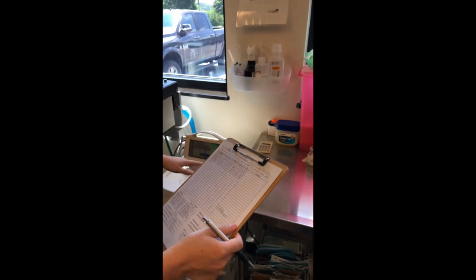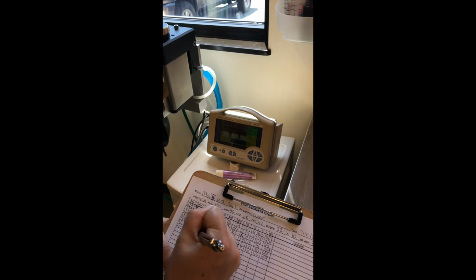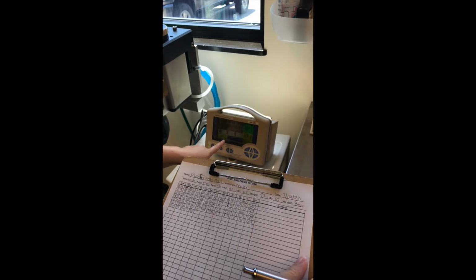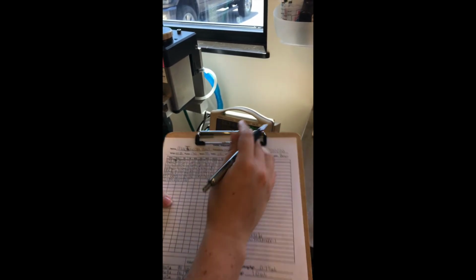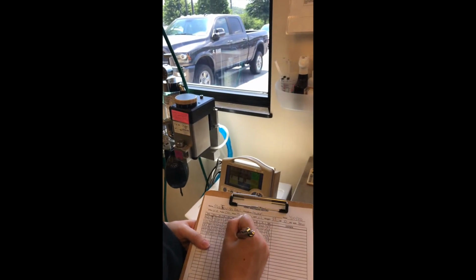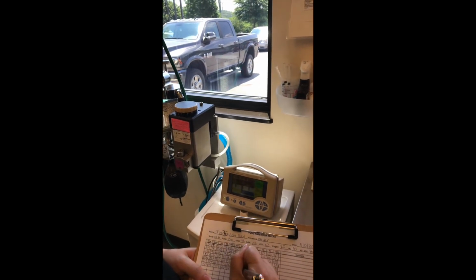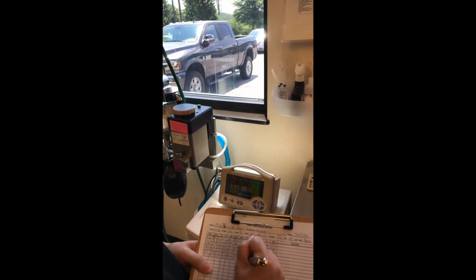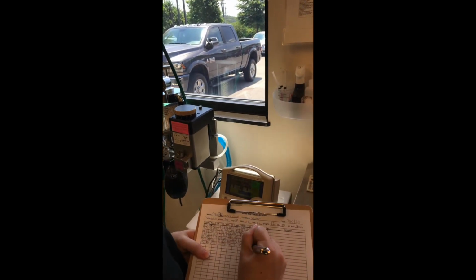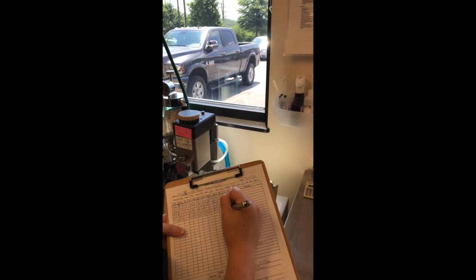And we have everything here that we read off of. His temperature is reading at 99.6. Heart rate is at 107. Respiratory rate is 26. He is nice and pink. His SpO2 is 100. Blood pressure is 130. EtCO2 is 57. His ISO is at 1.5. Oxygen is at 1. Fluids are still at 110.